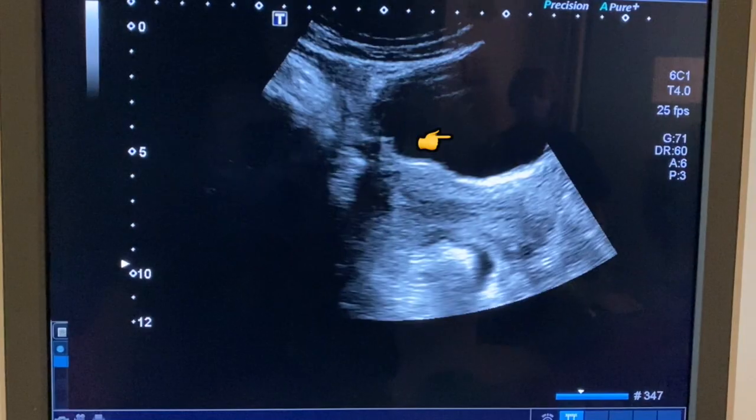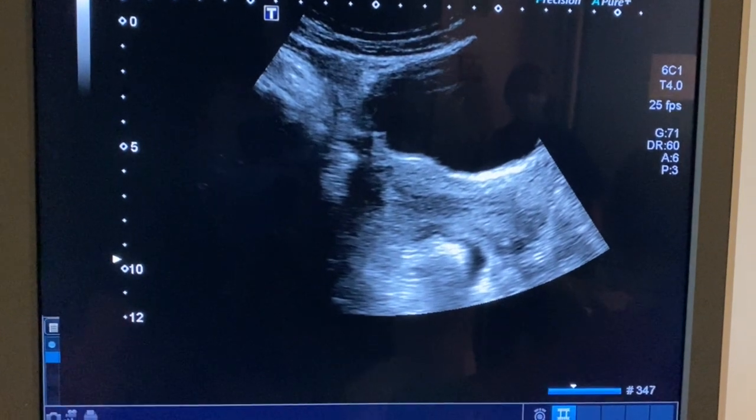Towards the very end, when we do ultrasound scan, often we see a bright bubble which contains the embryo in the uterus. I call it our shining star. Hopefully it sticks on and grows into a healthy baby for us. Here you go, that's the video. This patient has a full bladder, which is great for transfer.